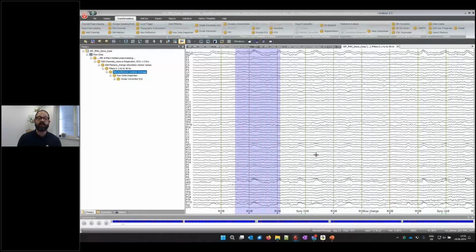And this can also be avoided with a common average reference. But also, if you're lying in the magnetic field with your EEG cap, the effects on the different electrodes could be differential in different places. So therefore, using the average of all electrodes should also make sure that no bias introduces the new reference via this route. So this is something rather nice to do.